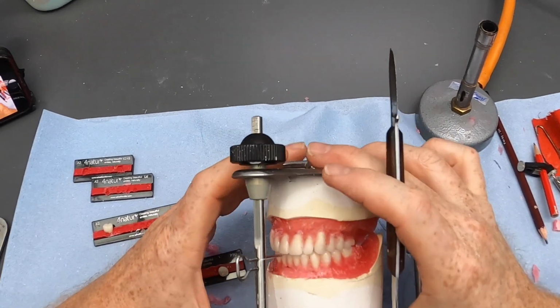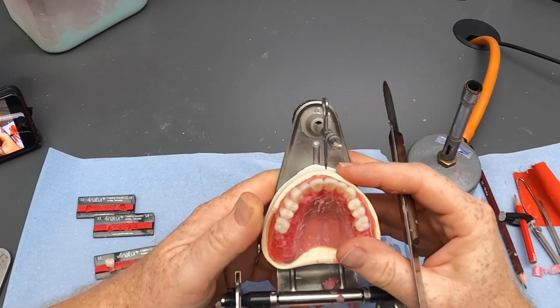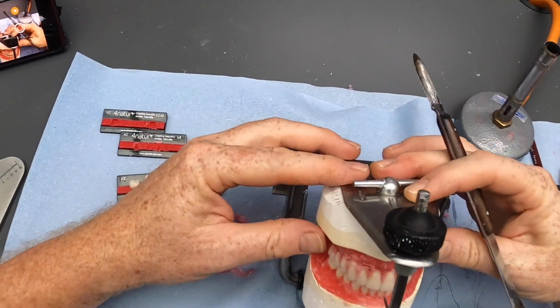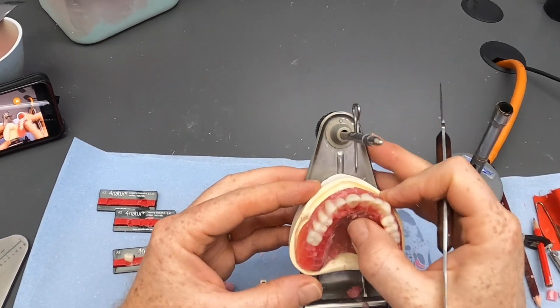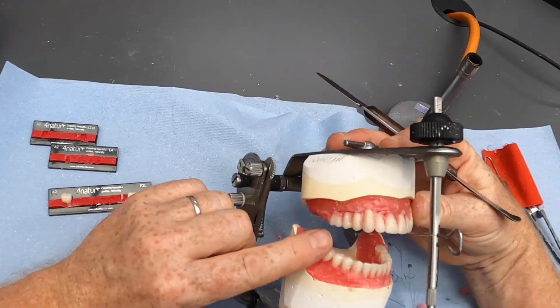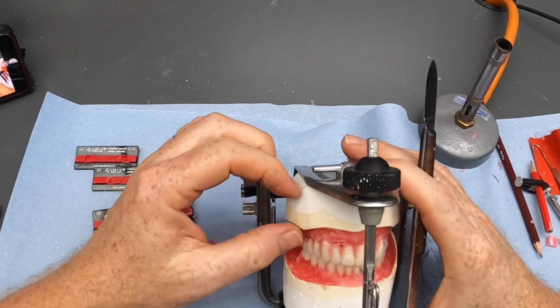Okay, so we're just about there now with setting up our teeth. I was a bit concerned that this right hand side was just drifting out a little bit into the buccal corridor, so I just checked where the position of my lower 6 was. It's just coming a little bit wide. Obviously we'd check that at try-in, and if it was a problem then we may well set that tooth in crossbite, so put that tooth in and have the buccal cusp going into the central fossa, or somewhere in between. There's a compromise in between the two extremes, if you like.